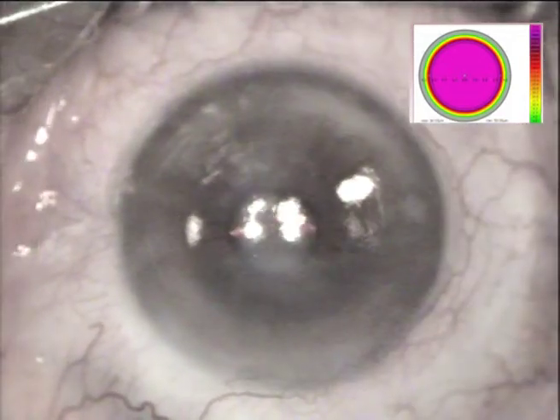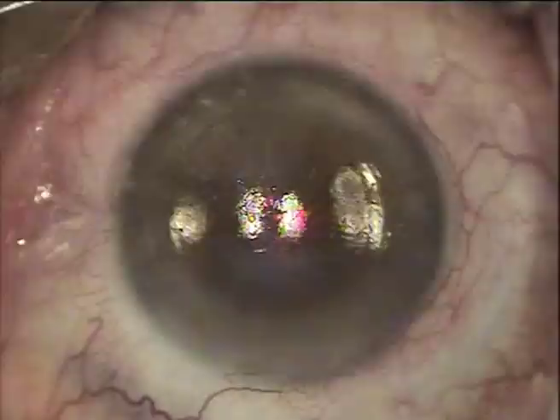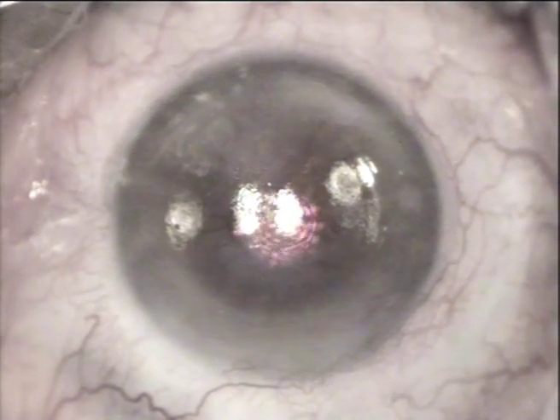So we'll remove the epithelium with PTK in order to address the possible irregular thickness that nature has made over this extremely irregular cornea. This is real time, the PTK mode, and then we'll go on to the topography-guided ablation, which is a very irregular ablation, as you will see in a few seconds. Again, this treatment is performed with the Alcon EX500 excimer laser, and it gives us the ability to monitor in real time online the actual corneal pachymetry.